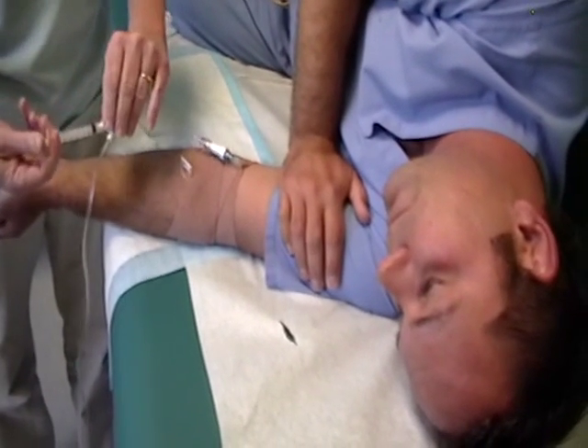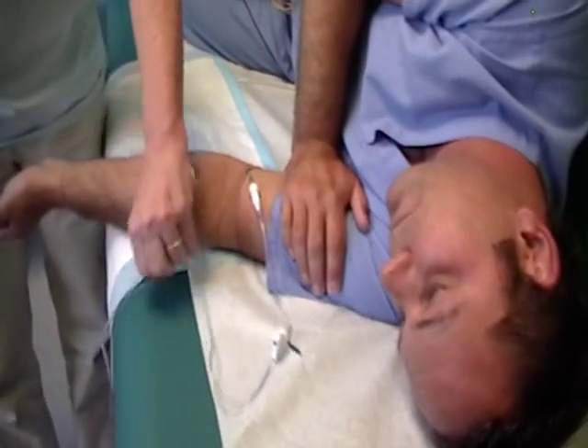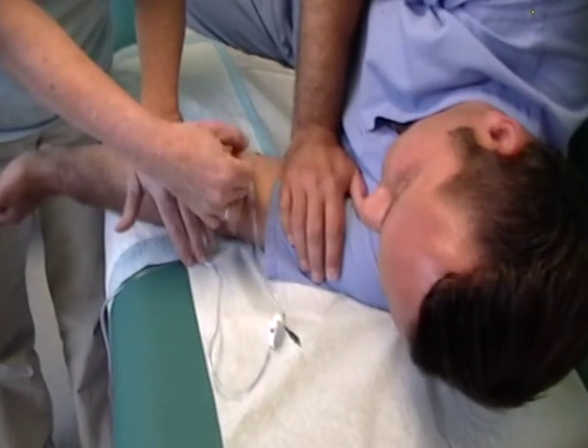And as you saw, Pat cleaned the little connection port really well with alcohol before the IV push, and that is always very important.